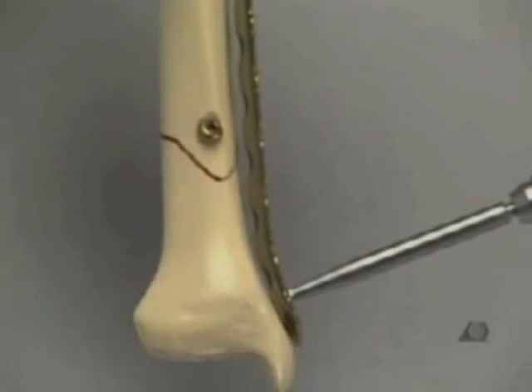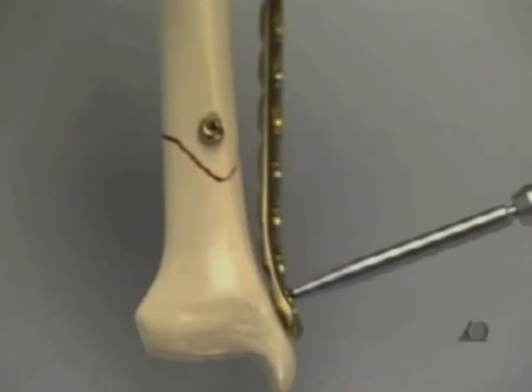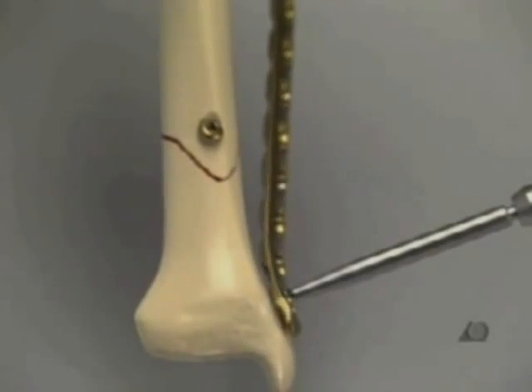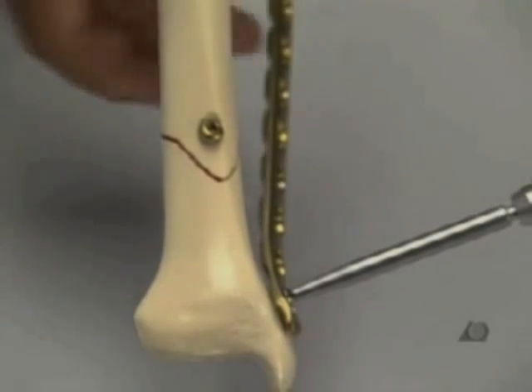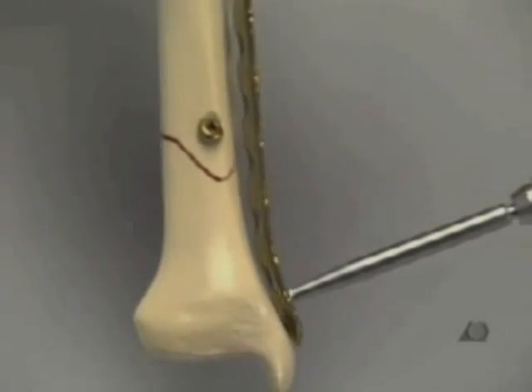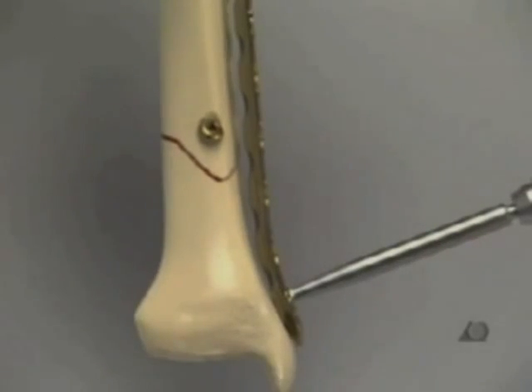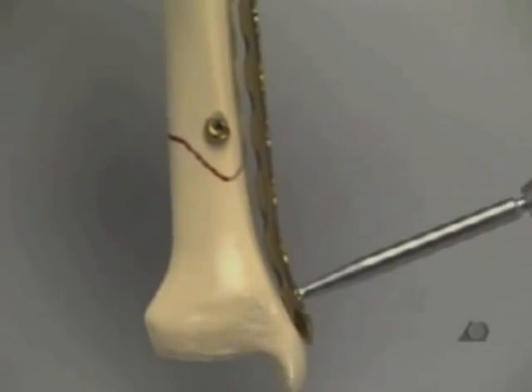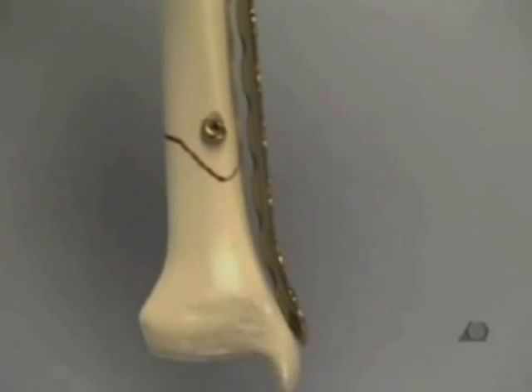At this point, if the other end of the plate is not well secured, the helicopter effect will be created. Therefore, before completely tightening the first screw, the plate is fixed to the bone using the most proximal screw hole.